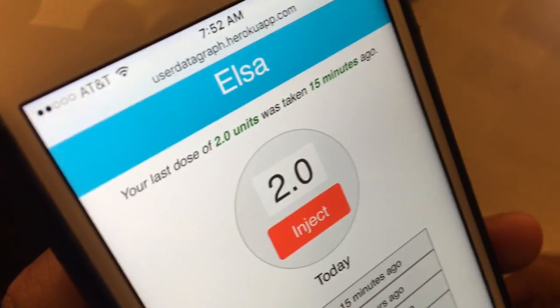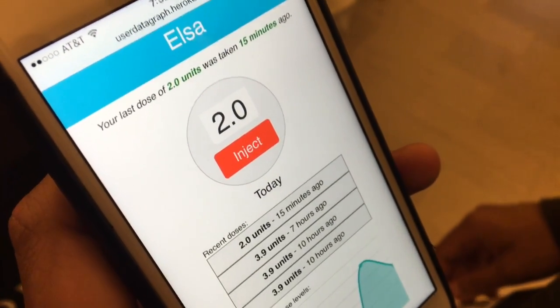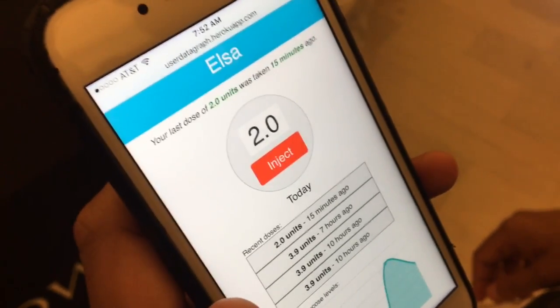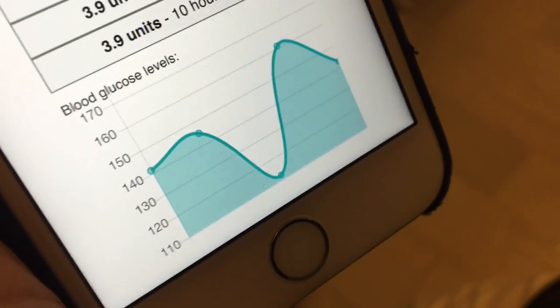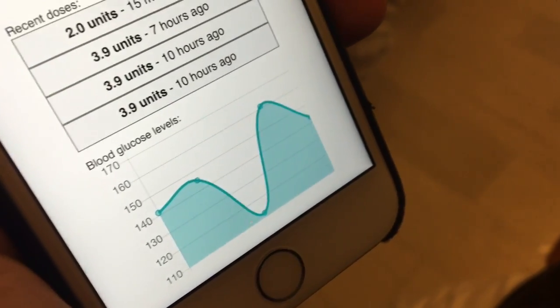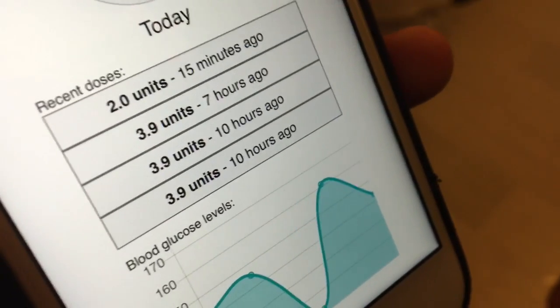We tell them when their last dose of insulin was, and we also show the amount of units of insulin that we recommend they inject. So currently it's 2.0, and we've calculated that from all this blood glucose data that we have. And so we've pulled all this data from the API, and we know that this is the blood glucose level of the patient over the past day or two. And you can also see the most recent doses of insulin.